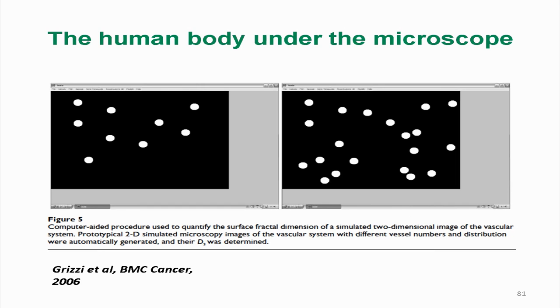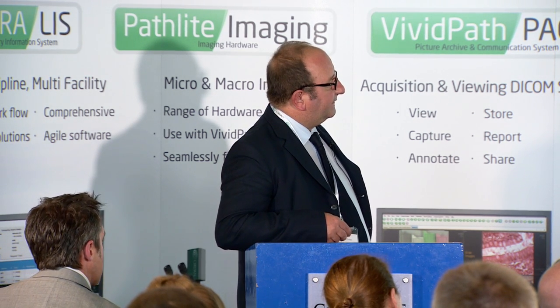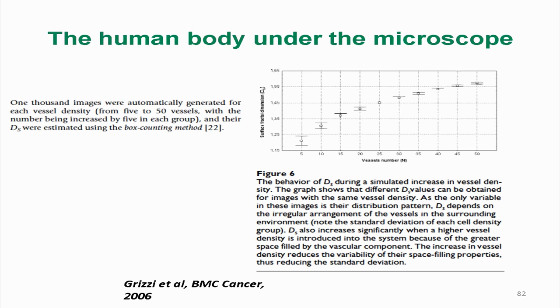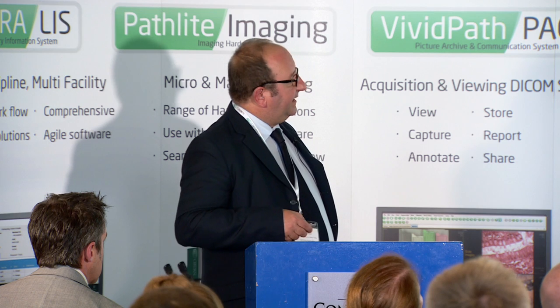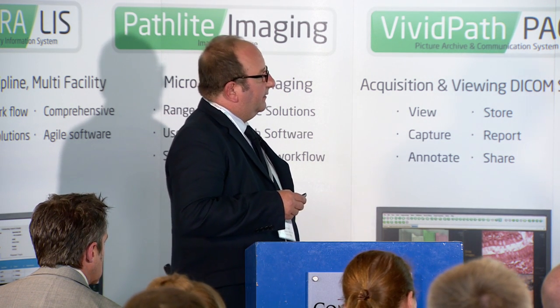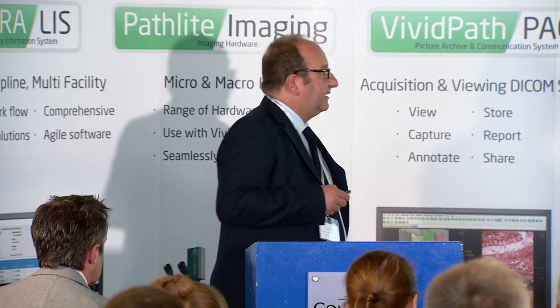In addition, we implemented a computerized procedure to understand whether the different configuration of the vessels is important or not. We found that by increasing the vessel number, we have an increase in the filling space of the structure, but for the same number of vessels, we also have different complexity. This demonstrates that it is very important to quantify not only the density of vessels, but also their pattern distribution.